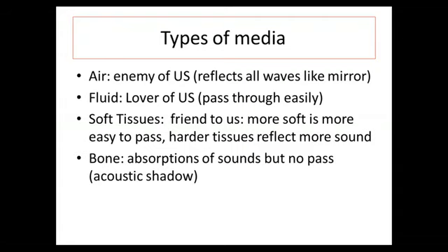And more soft tissues contain more blood, the same like muscles, and harder tissues contain less blood, like pleura, peritoneum, and pericardium. Bone. Ultrasound cannot penetrate bone, but the surface of the bone will appear like a crescent, and anything below the bone will be just a shadow.